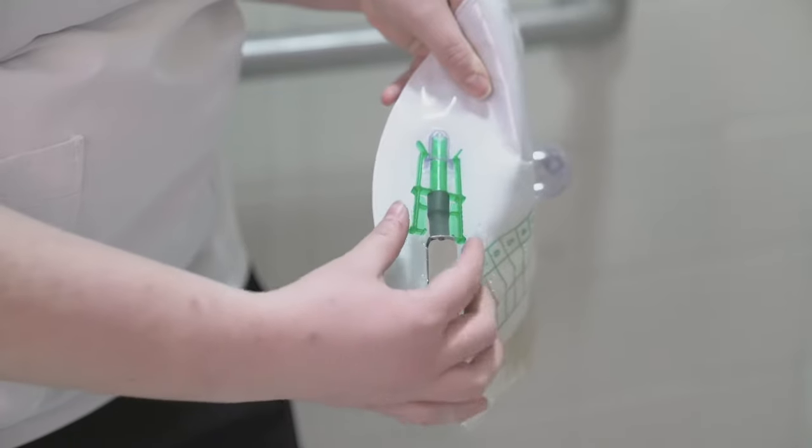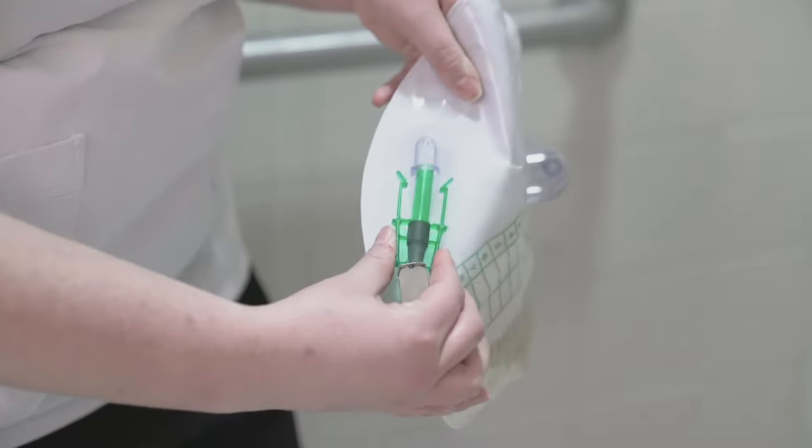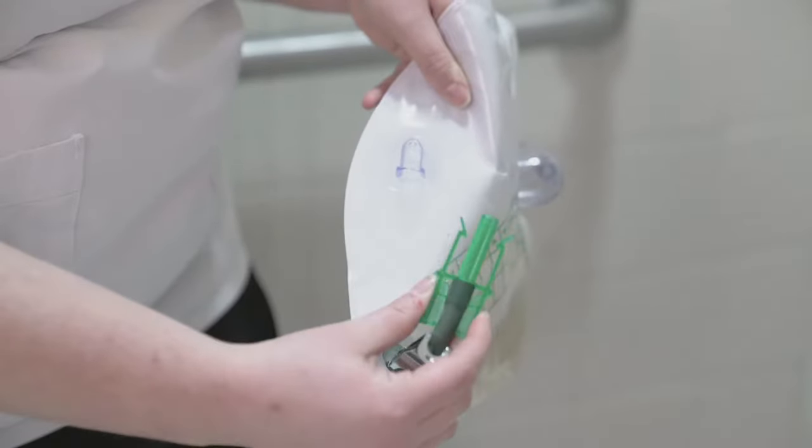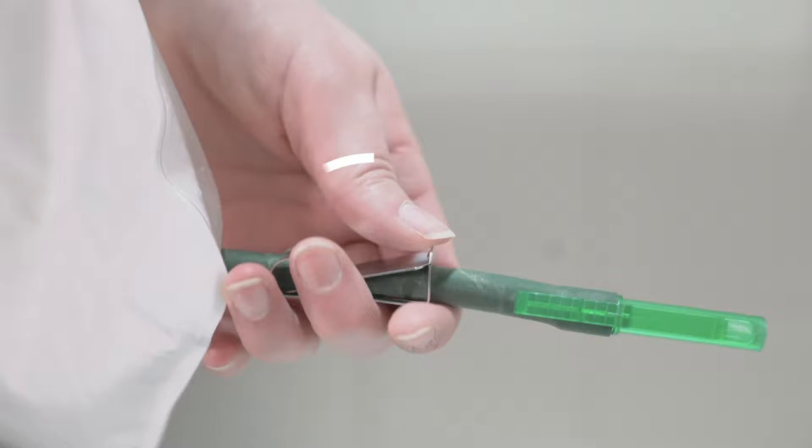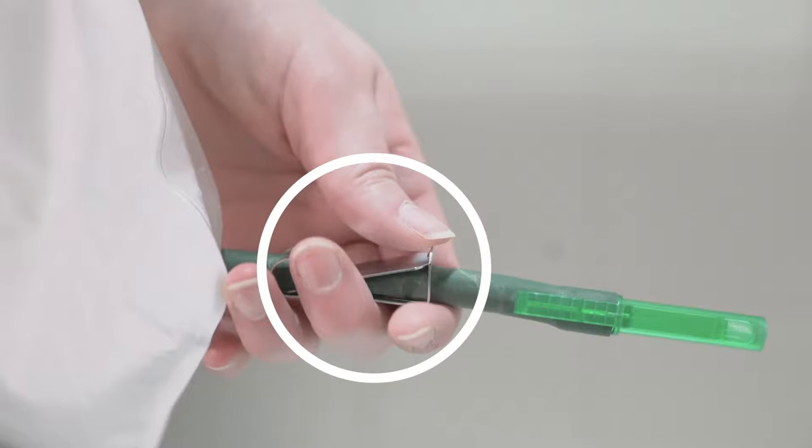Let's go over how to empty the Foley catheter bag. First, unclip the green clip from the bag. This clip keeps the part that empties from dragging on the ground and collecting bacteria. Next, locate the metal clip. This clip keeps the urine from coming out of the bag.